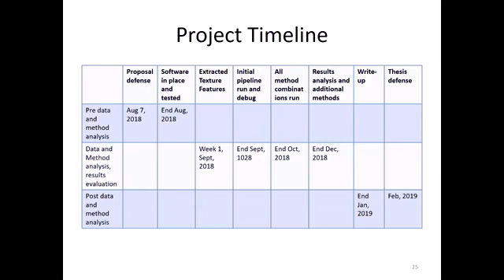Yeah, so this is one other limitation I'll bring up now: we may run into problems because, as we've gone through, let's say you have a patient and you get 6 slices. Obviously you're going to get a very large slice with a lot of texture information, but some of the smaller slices you get are going to have poor texture information. Those may add noise to the data set because even though this is malignant, it's hard to differentiate it from the benign, and so we may have to toss some of those small ones out.